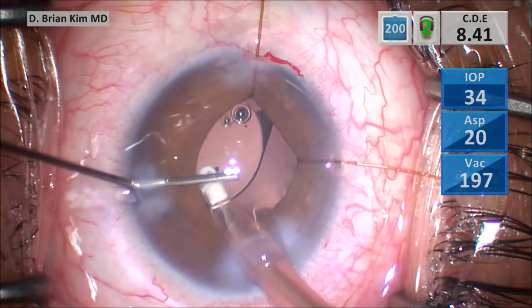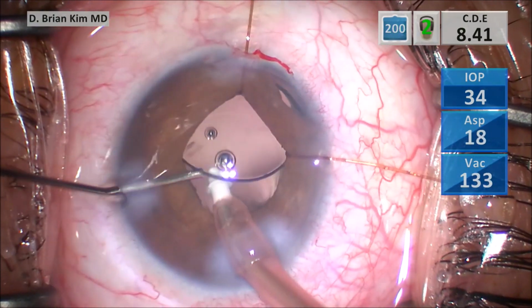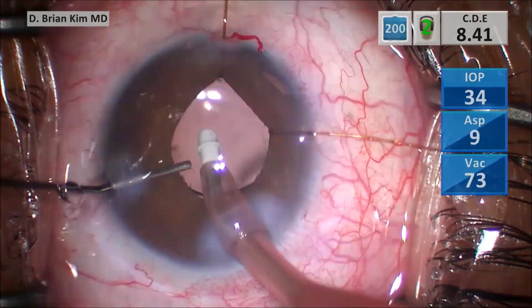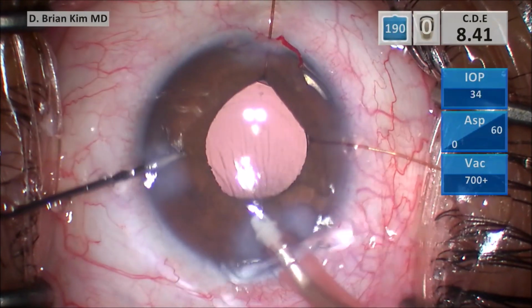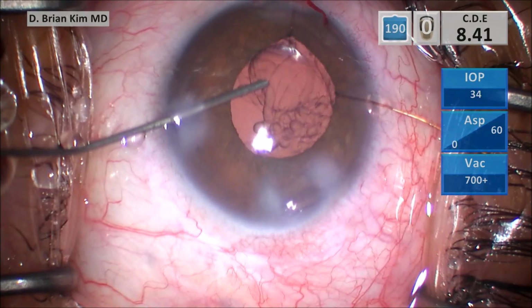making sure both haptics are in the bag as well. You can see the cataract's all removed now, nice clean bag, and the lens is within the bag. Decompressing the chamber, and now this is some dispersive viscoelastic to fill the chamber, coat the cornea, and now we're going to go after the iridodialysis.